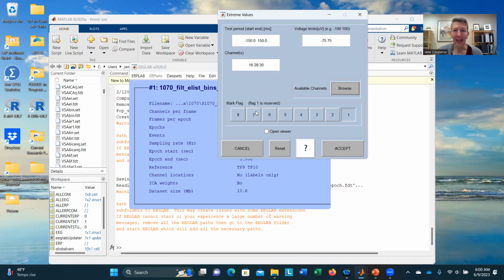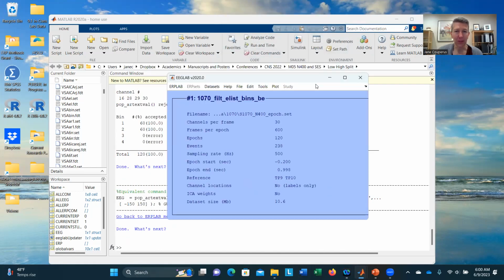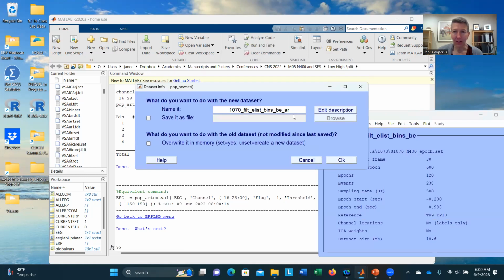So it's going to say, what flag do you want to set? That I'm going to say set flag 1 for all of these artifacts. And I'm going to go ahead and click accept. And what you'll notice is in the background, things are happening. And I'll show you that in a second. Let me just save this.